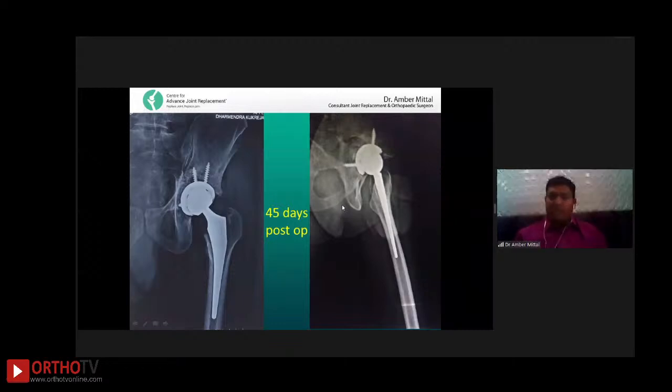So there was sufficient coverage for me during the surgery. I could get a press fit during the surgery, so I did not require a special cup or cage construct. I kept everything ready, but I could get away with a simple multi-hole cup. Because it was a 3 month old injury, I could get a rigid fixation, and I used multi-hole cups and kept the patient non-weight bearing.